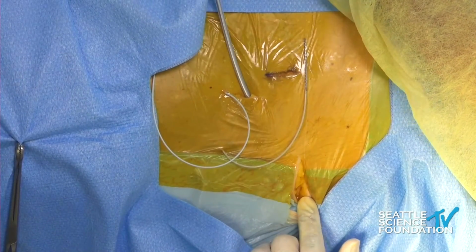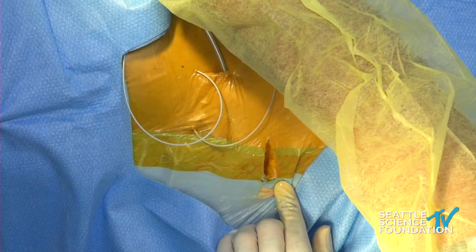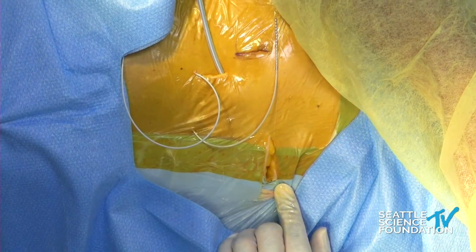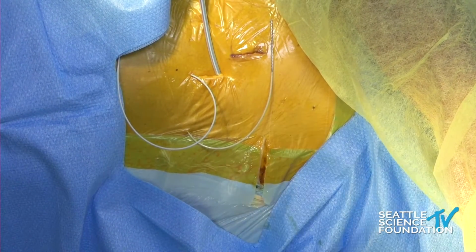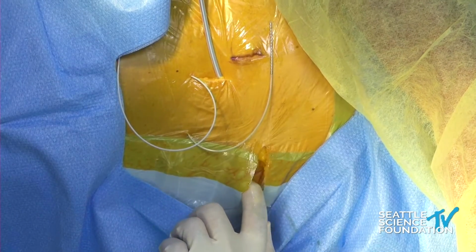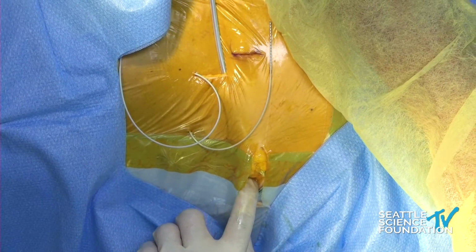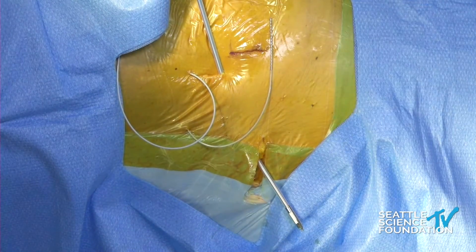And then what you can do is you can see where the tunneling tool is going. So you can see if I rotate this way, I'm going more cephalad. If I go this way, I'm going more caudal. And then I need to make sure my depth is at the level of the IPG, not too superficial where the lead comes down. So you really need to think in 3 dimensions. So without poking yourself, I can see, if you guys can notice, the tip is coming through, and then I can come right through that pocket site.